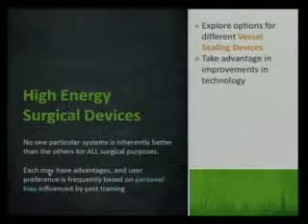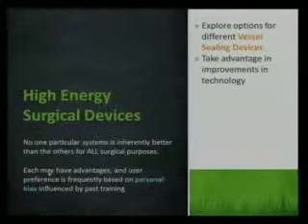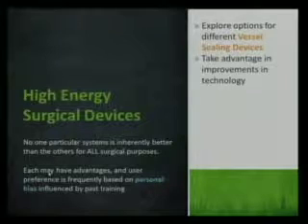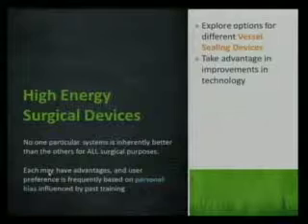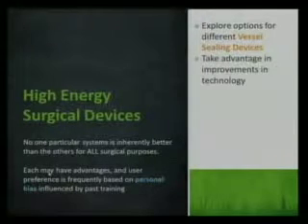And they pair that with the beeps that y'all hear. That's the different resistance in the tissue. And when it gets to that final beep, then it does not send any more energy through the bipolar device. So it automatically regulates it for you.